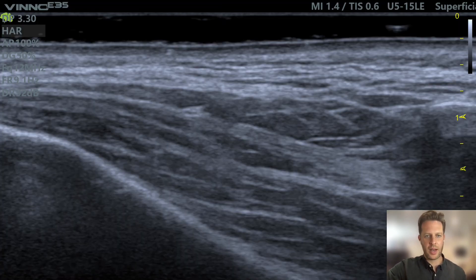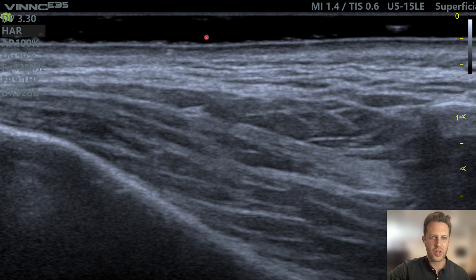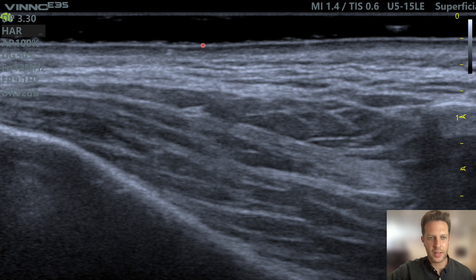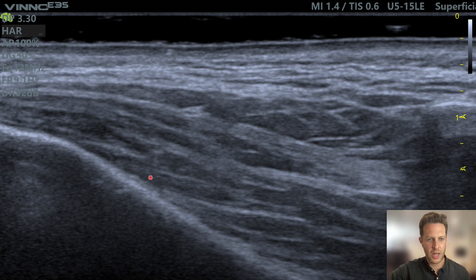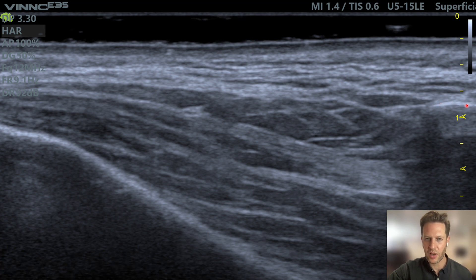Let's take a look at this image of the temple region. This is a well-optimized image. At the top of the screen we have the gel, then clearly visible are the epidermis layer, the dermis, and the first bright white line which is the superficial temporal fascia. Then we have the superficial fat pad, followed by the deep temporal fascia. Below that, where the fibers are well aligned, is the temporalis muscle, then the temporal bone at the bottom, and the clearly defined zygoma bone.